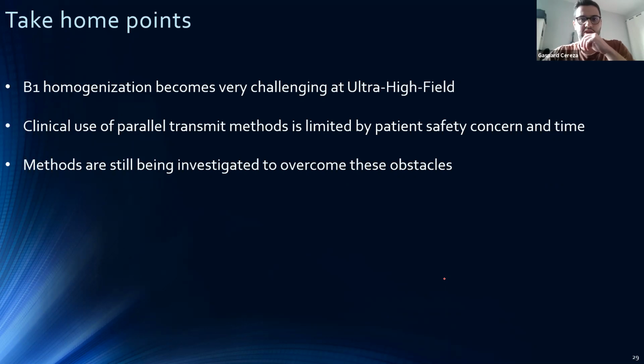So right now it's only used at 3T. And a lot of methods are still being investigated in order to overcome these obstacles and to make it available clinically. So thank you, everybody.